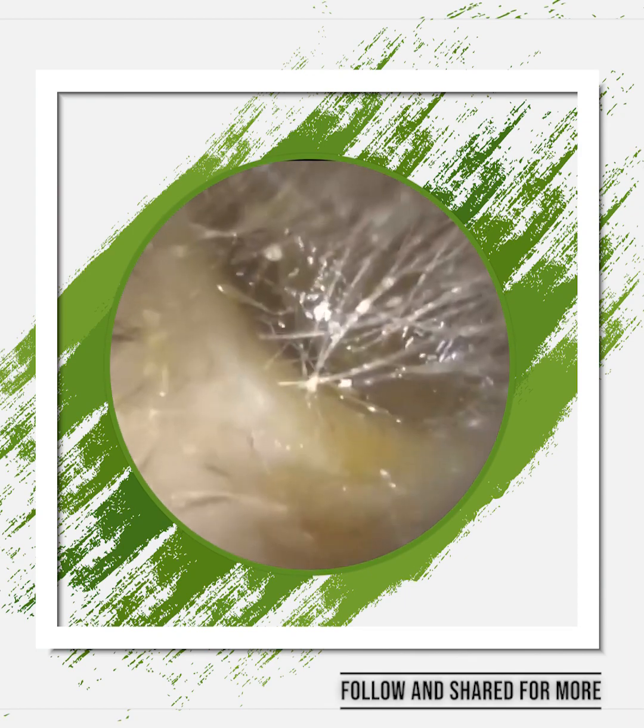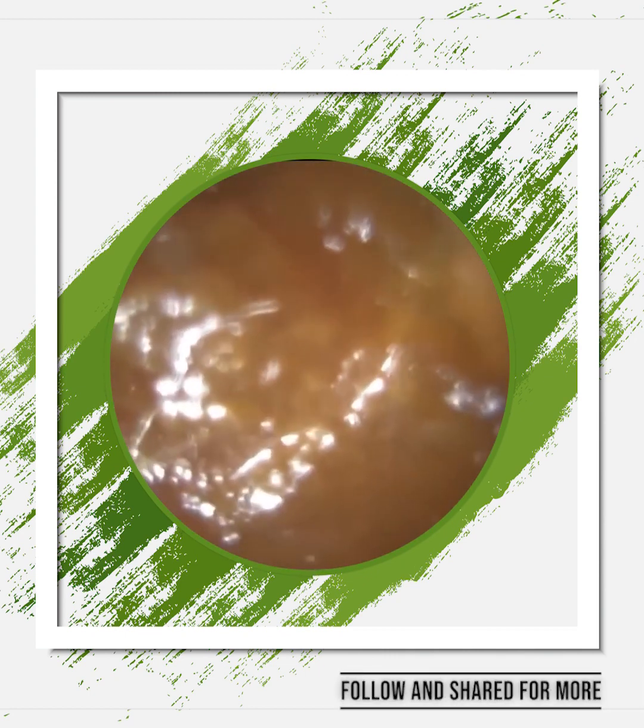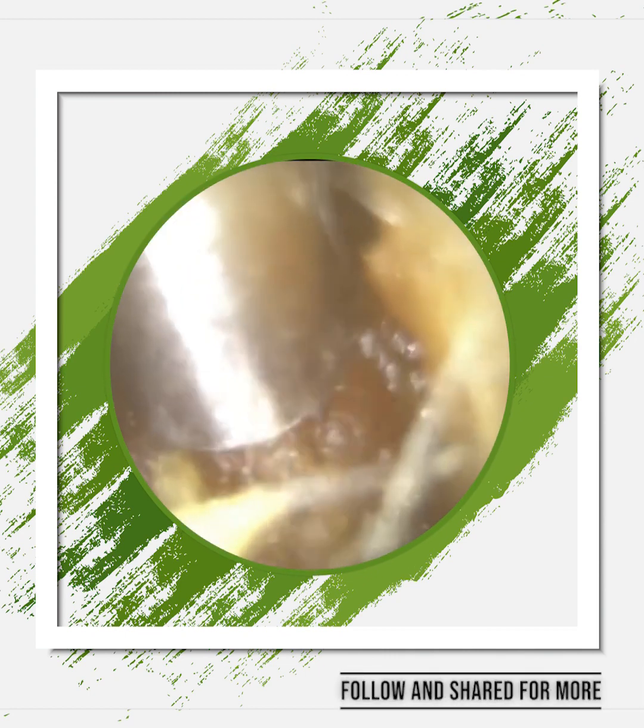Thank you for joining me in my latest video. I have a patient who attended here with fully blocked earwax in both sides, and we're just commencing in their right ear. And you can see the entrance of the ear canal is completely shut, it's closed, it's collapsed upon itself. So what I'm having to do is dilate and stretch the ear open.